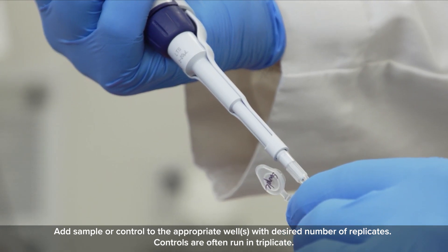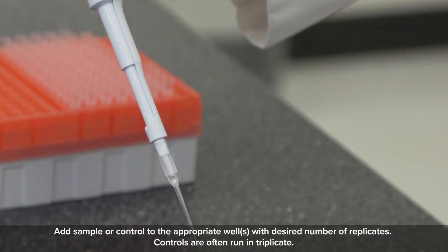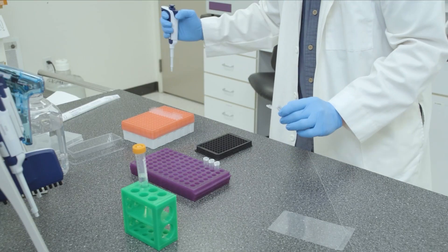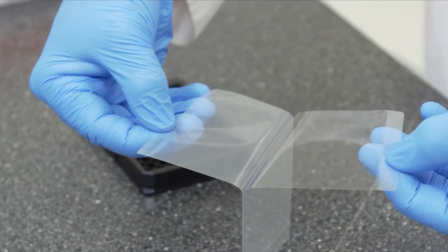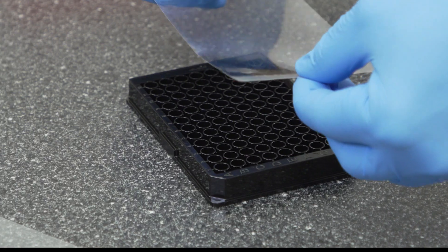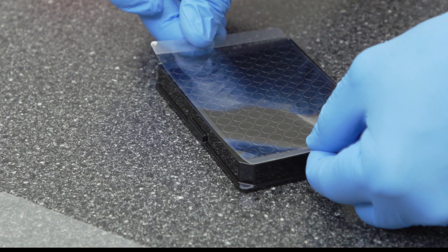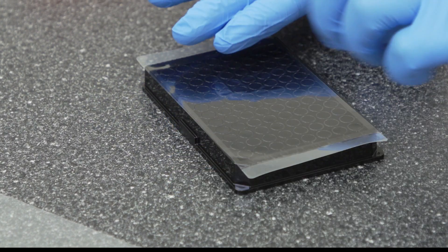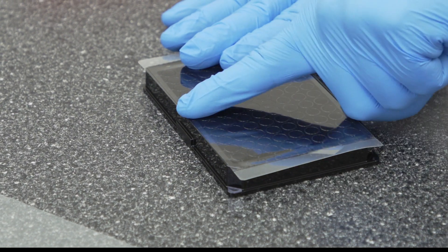Add sample or control to the appropriate wells with the desired number of replicates. Controls are often run in triplicate. After all samples and controls are added, seal the plate with clear film, ensuring that the film is fully adhered and that the wells are all fully sealed. Drying of a well due to insufficient seal will cause a false positive result.